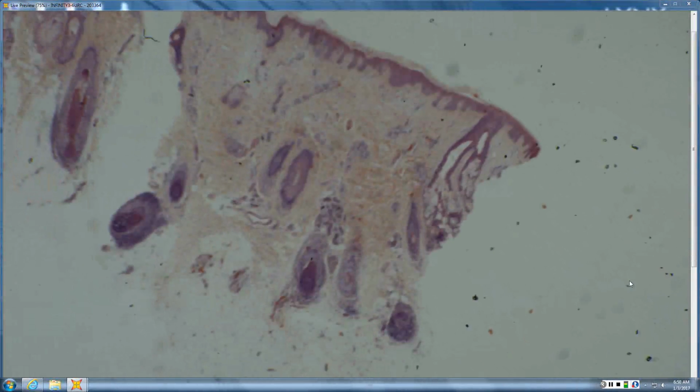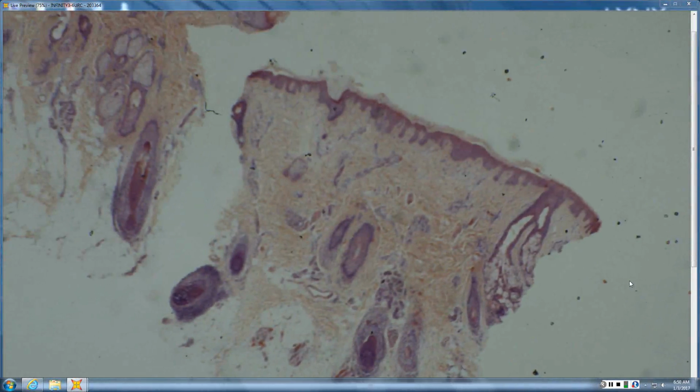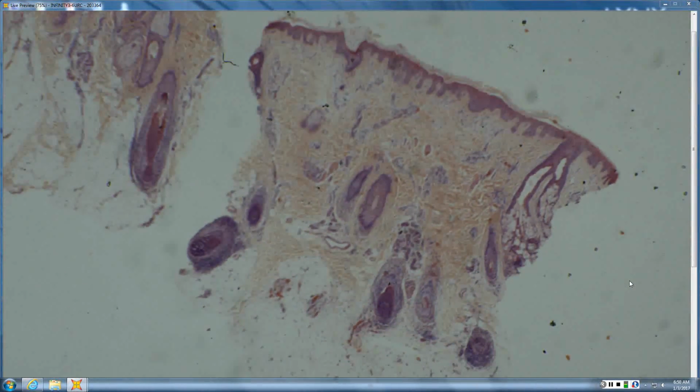So this one is actually a really good example of alopecia areata, and unfortunately, most of the examples that we get are not this good. And sometimes the findings are pretty subtle. Of course, it depends on where you biopsy. That goes for a lot of things. Where do you biopsy for discoid lupus versus LPP versus CCCA versus alopecia areata? Some of those things matter, and of course, as you guys know, biopsying for H&E versus biopsying for DIF, all those things are beyond the scope of the next few minutes, but are very important, and it changes what you see on pathology.